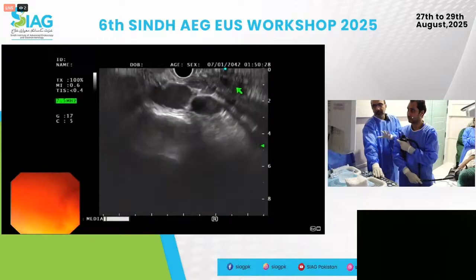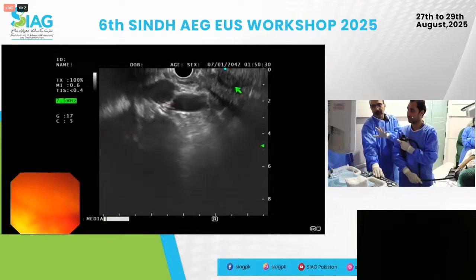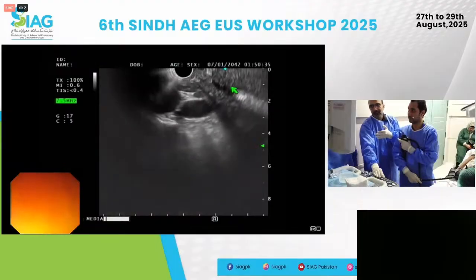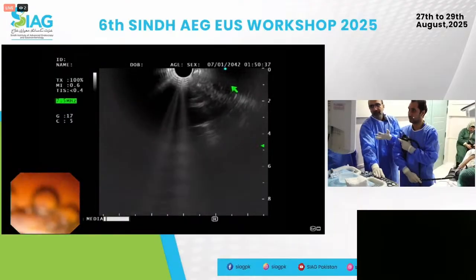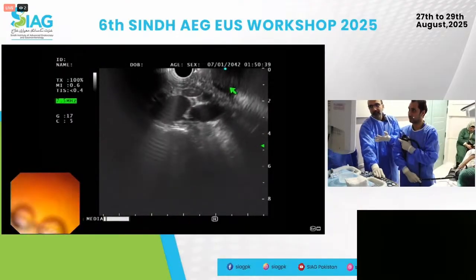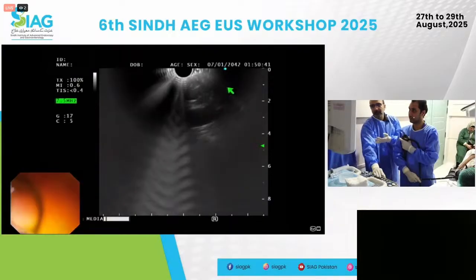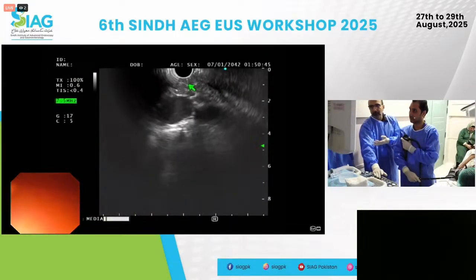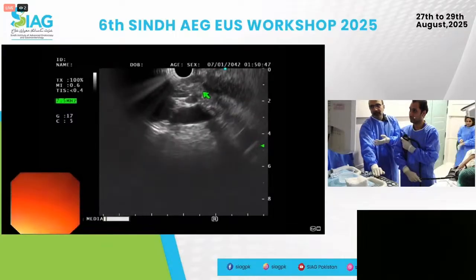Don't do anything other than just pulling back. Don't spin around. Just relax. Keep pulling back. Bring this guy to about here. So relax your big wheel and keep pulling.